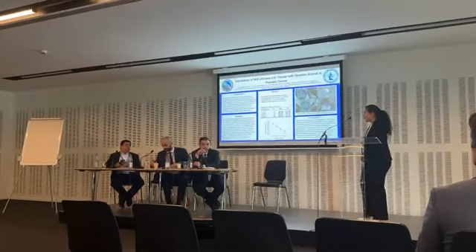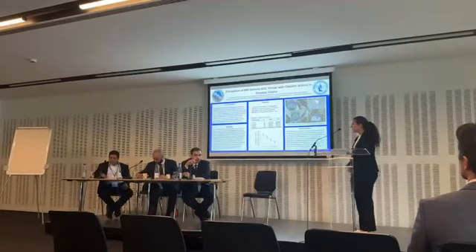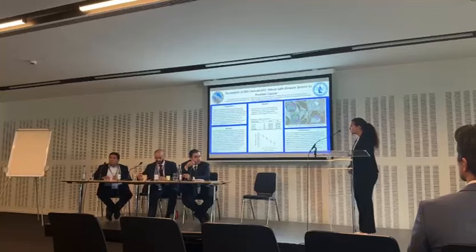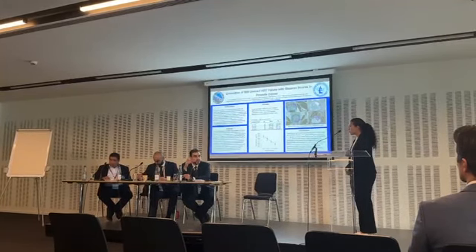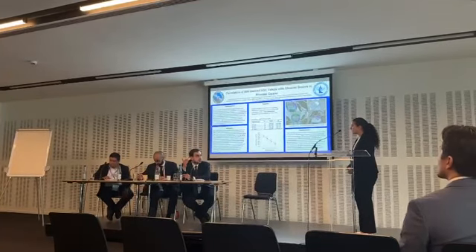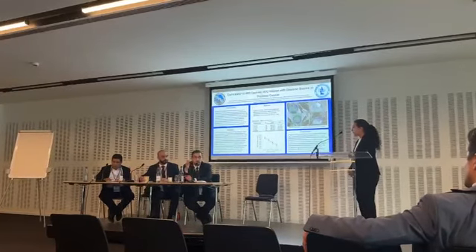I have a small comment. I think it's a great paper, and I think it's a good start, especially for active surveillance patients. Imagine a patient that you already did a biopsy for and you're following him with MRI. It's a cheap tool and you're actually doing it for the patient. And if you're confirming that there is no upgrade of the disease over time, that's actually a good measure without needing to do more invasive procedures later on. I mean, we can skip biopsies.